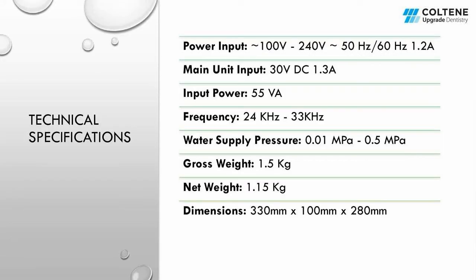These are some of the specifications of the device. Now, this part is commonly ignored, but it has to be ensured that this device has proper voltage and all of the things that are required to function properly, because without those prerequisites, the device may not function properly and it may get damaged afterwards. So please ensure that these parameters are maintained so that the device performs at its optimal capacity.